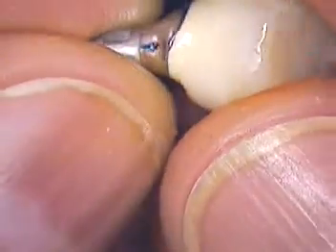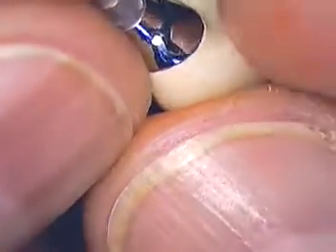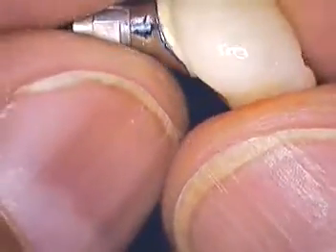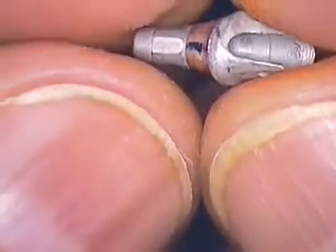Fairly decent adaptation. There was a little bit of an air-abraded area in the saddle region and I took care of that and had them re-glaze the case. So we're ready for trying now. I'm going to see if I can film some of this for you in the mouth so you can get an idea what this looks like.